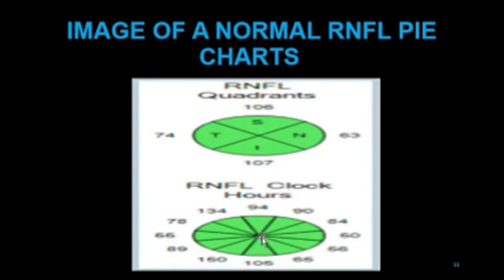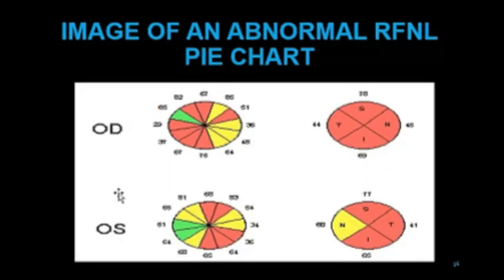It's showing us that something can be wrong here. When you check your nasal in this diffuse chart, nasal can be showing green, but here it can show you yellow or red, showing that as much as generally this whole nasal part might be healthy, there's something going on in a particular quadrant. Are we together? Are you with me? Yes. So this is an example of what I mean.